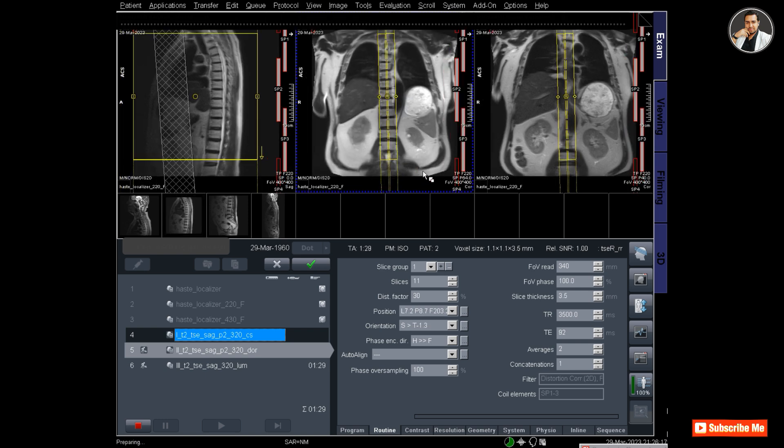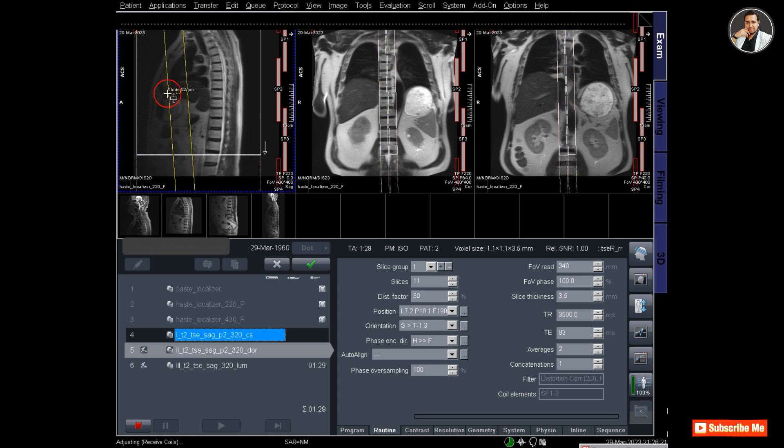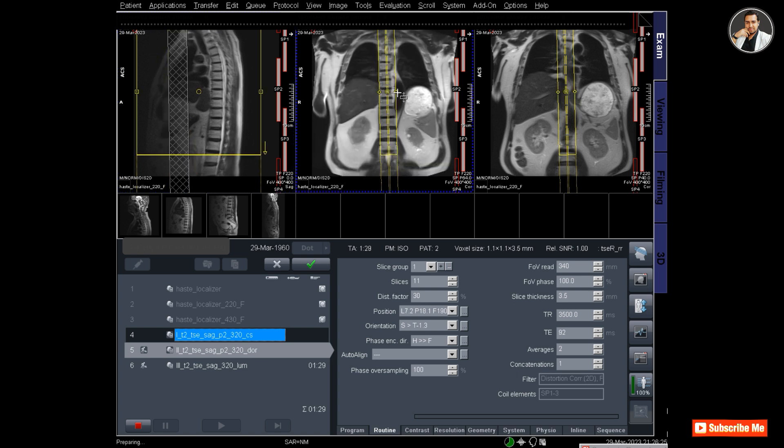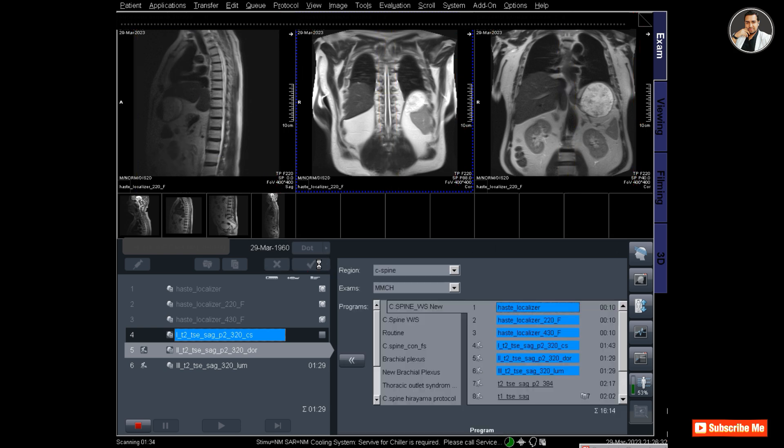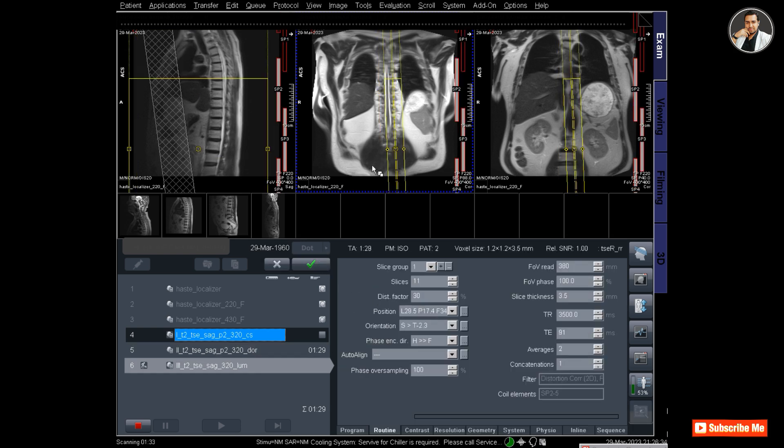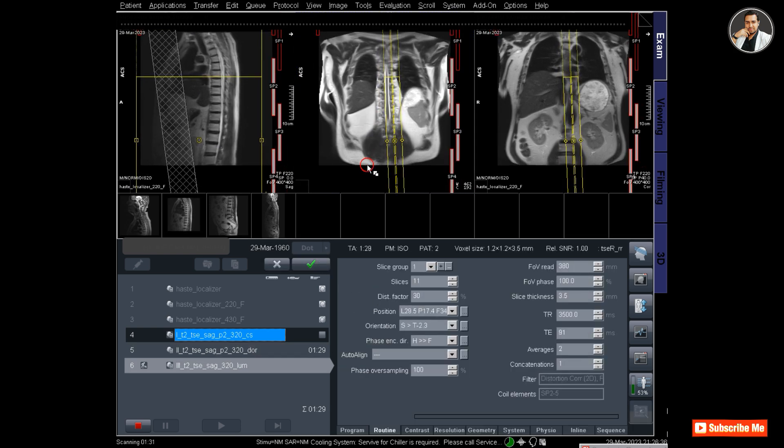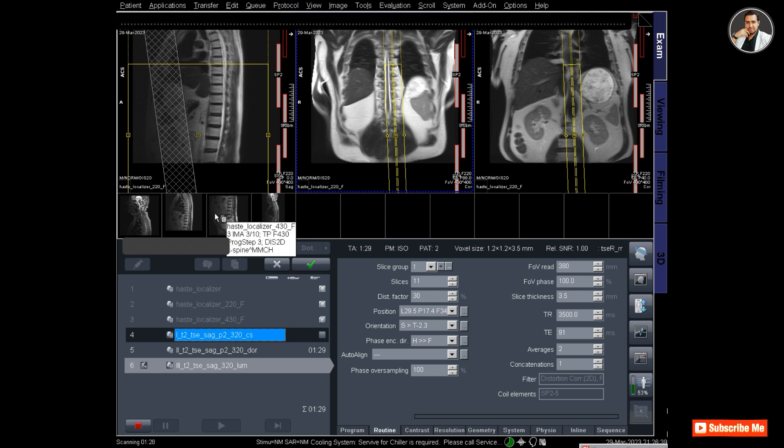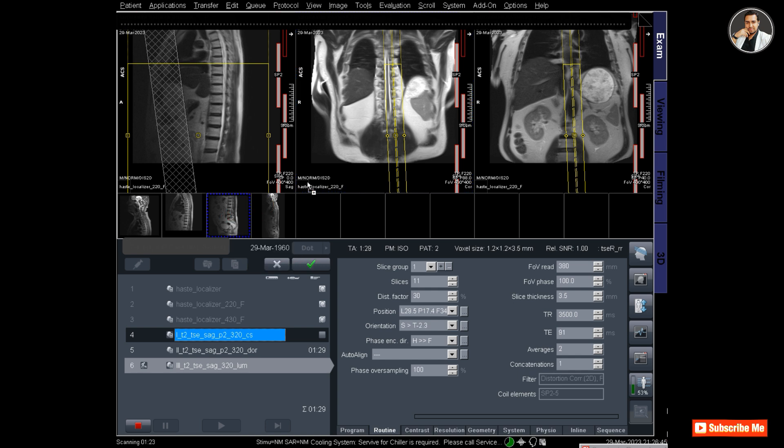Now I'm planning for dorsal. You can see that the slice number is also 11 here. The cervical spine sagittal T2 sequence is running, and I have planned the dorsal spine. Now I have to plan for the lumbar spine part.